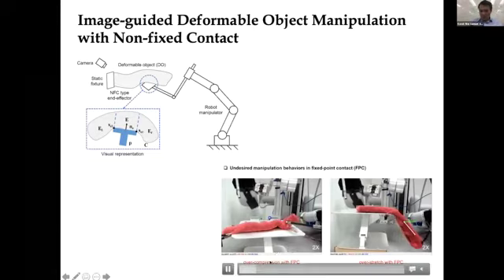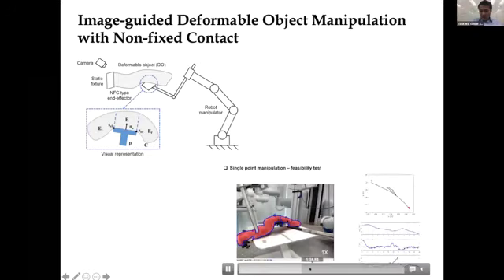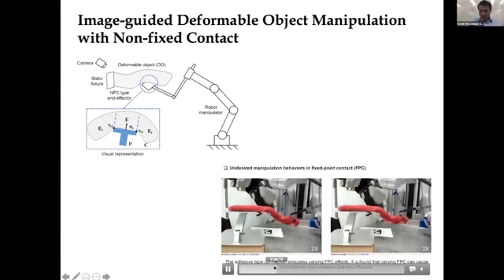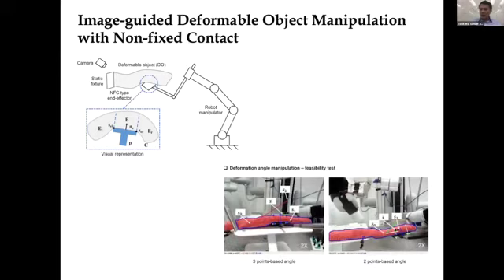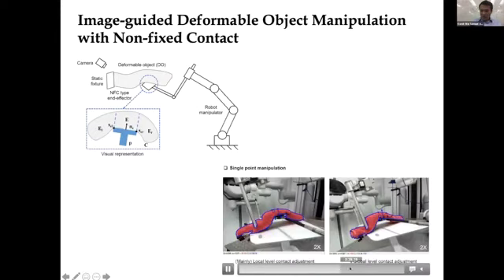And then we actually created a method that can work automatically. In this particular video, there was no human intervention. It's all purely based on camera images, and the computer uses AI techniques to drive the whole towel moving from one point to the other, fully autonomous and purely using the vision system. You can use an endoscope or some other camera. And then we set up different kinds of really soft tissue to see the robustness of the algorithm, and we actually did some crazy tests.